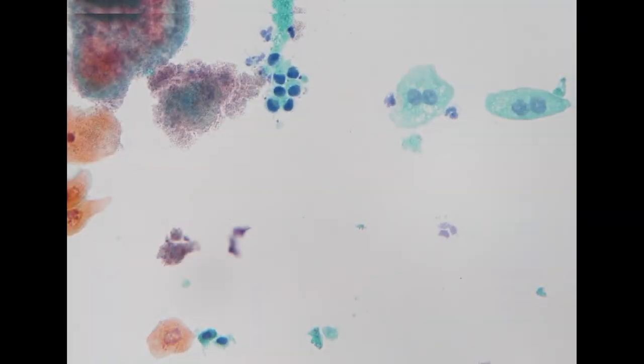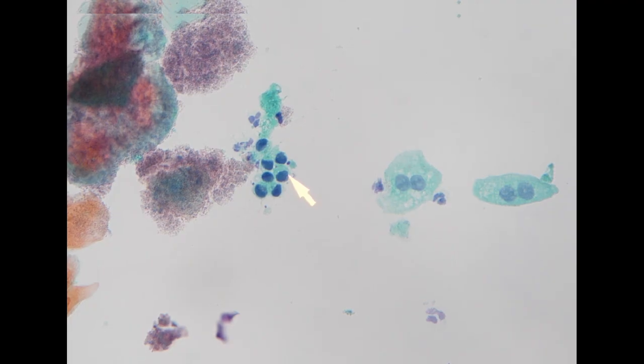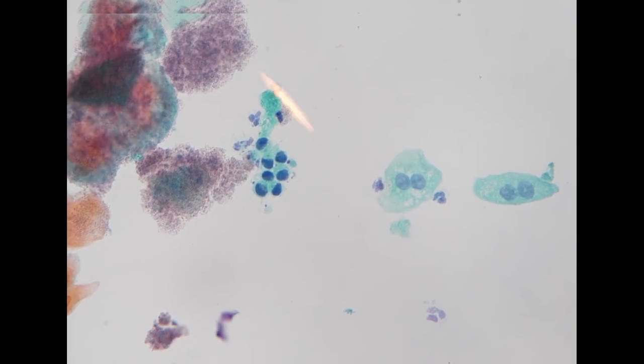So throughout the entire smear, there were a few clusters of cells showing this type of feature, but relatively not well preserved. So this is a degenerated cluster. The nucleus is quite small, which means that it has been degenerated, with shrinkage of the nucleus. However, you can appreciate the hyperchromasia is also a little bit abnormal.